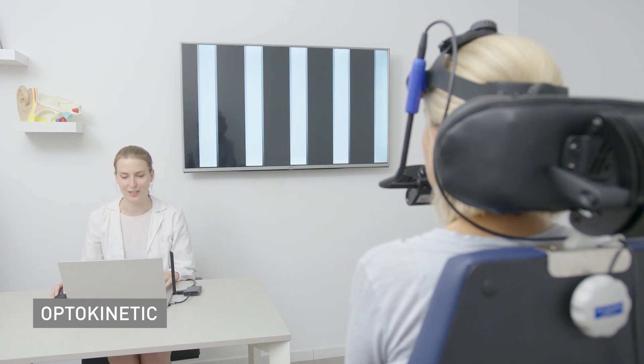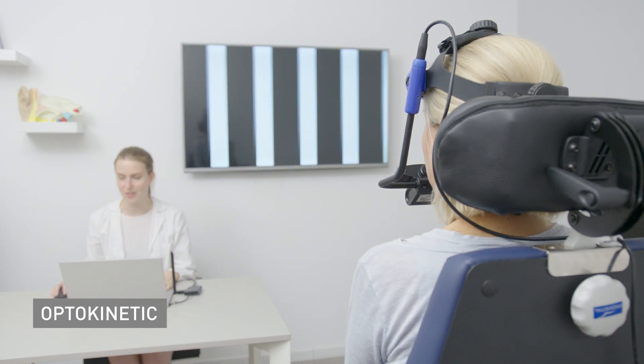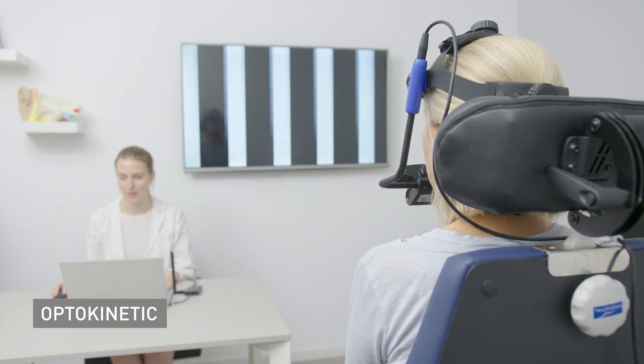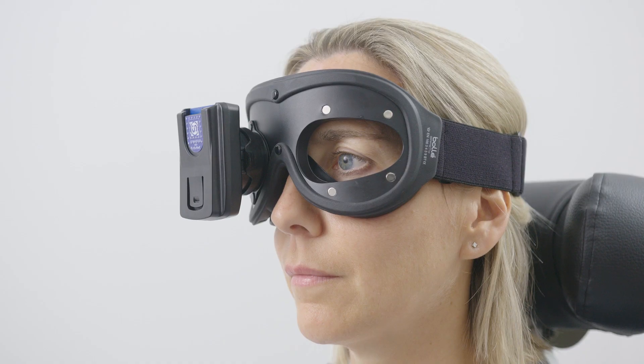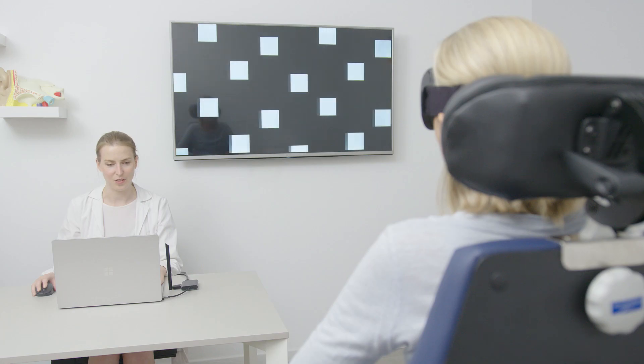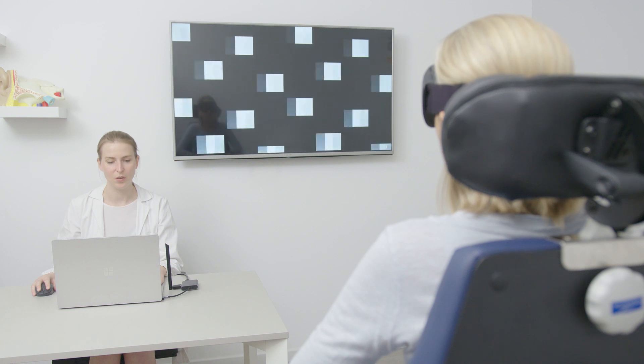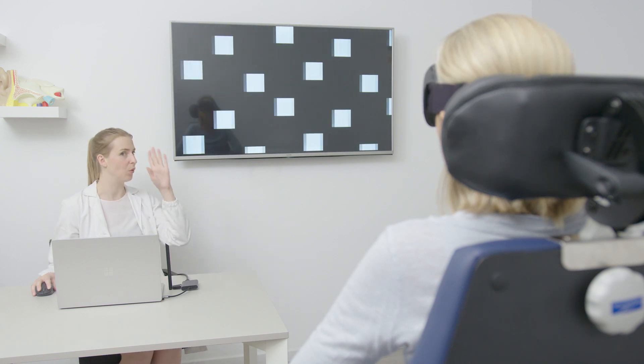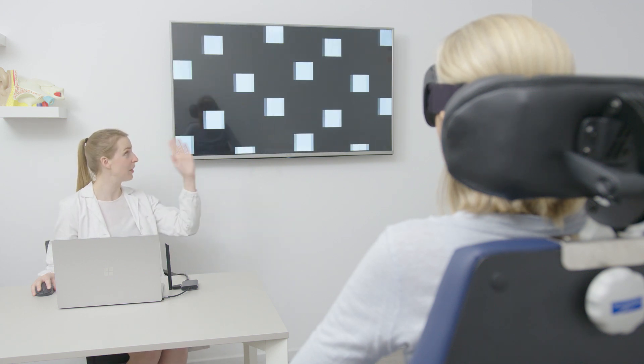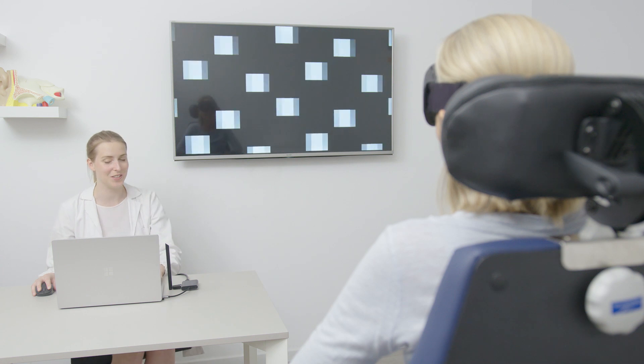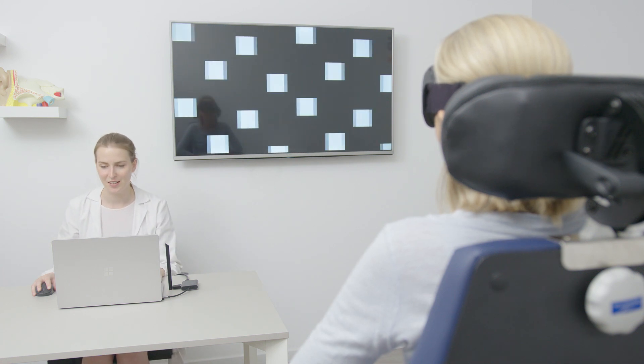The optokinetic examination offers versatility allowing testing with squares or columns as well as the ability to select different speeds and directions during the current examination. Alternatively, preset protocols built into the software can be used to improve operational convenience.